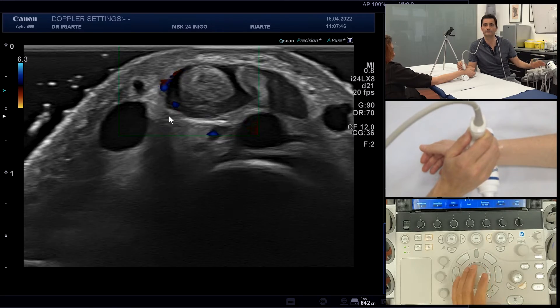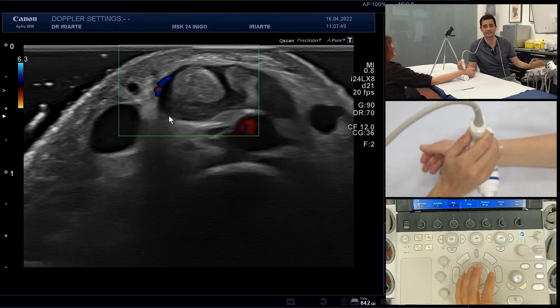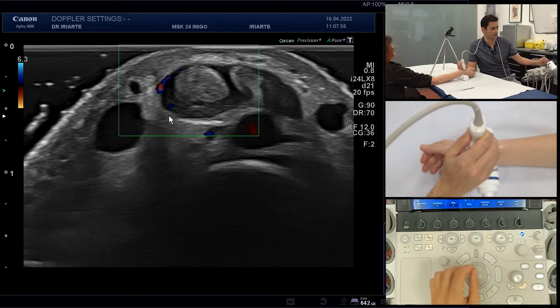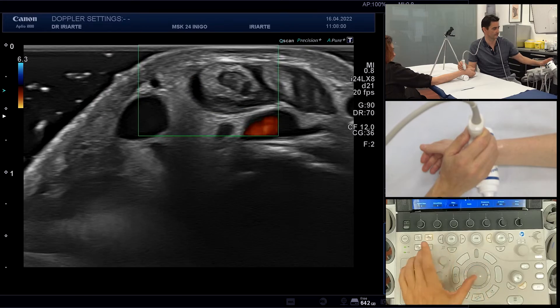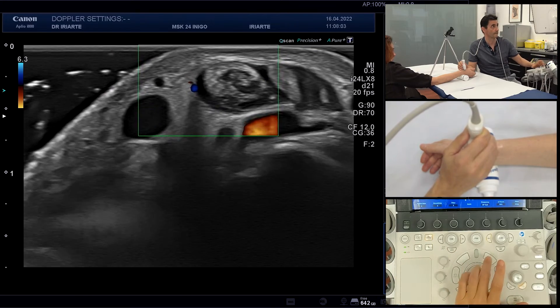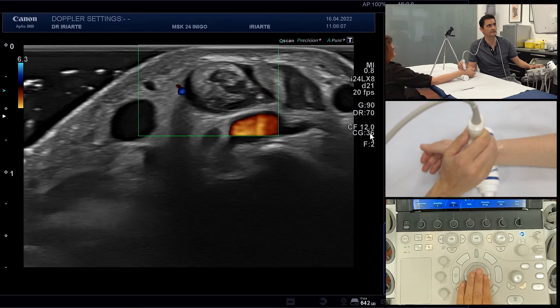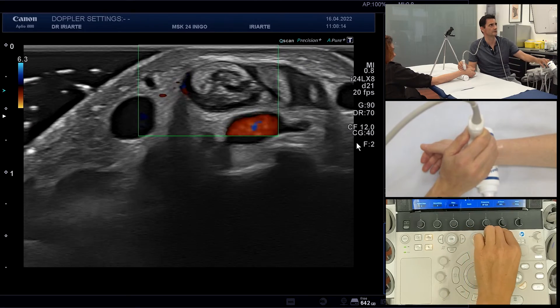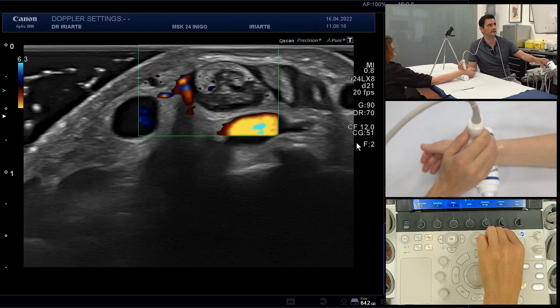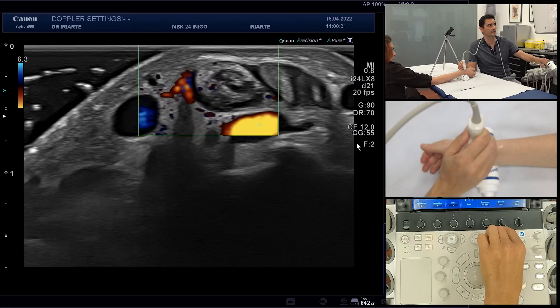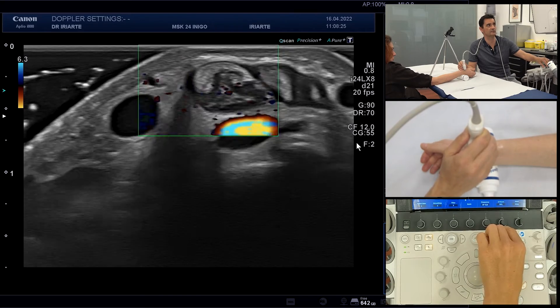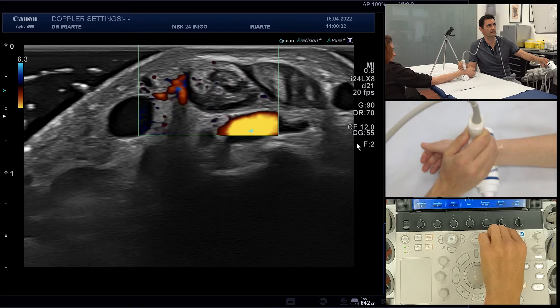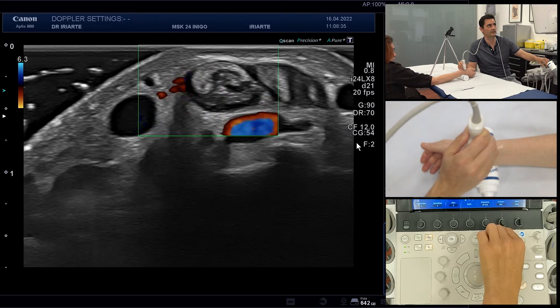The second parameter is gain. Doppler has gain just like B-mode, and its meaning is the same — it adjusts the sensitivity and brightness of the Doppler signal. Look what happens when we increase the gain: more artifacts appear. So you must use the gain at the highest level where there are no artifacts.